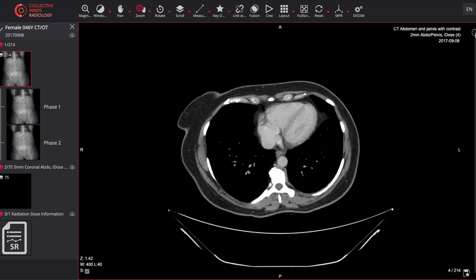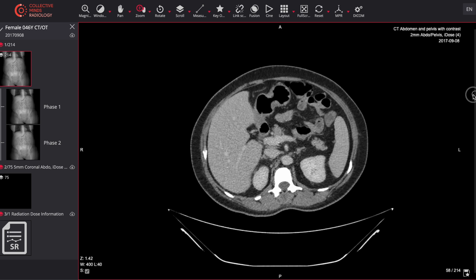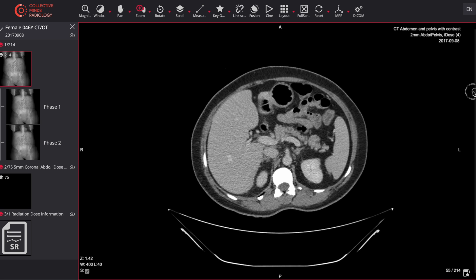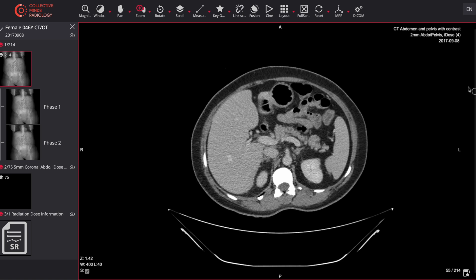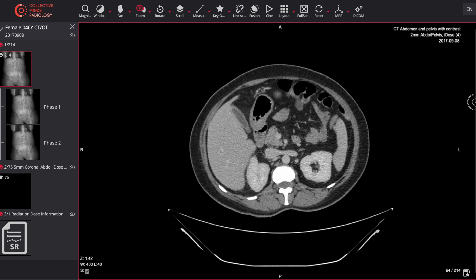Now let's get to this abdomen film. This patient has got right-sided abdominal pain. Let's start from the very beginning and find the aorta and the portal vein. The portal vein is sitting over here and the aorta is sitting over here. You can see that they are almost the same density as one another, suggesting that this is most likely to be a portal venous phase image. This is a contrast enhanced study.